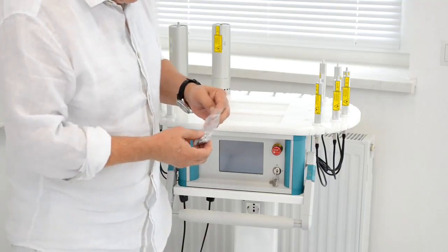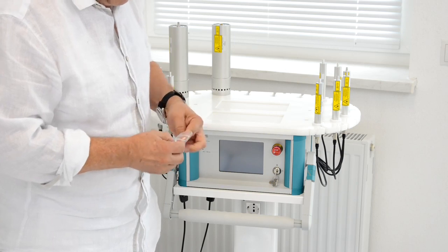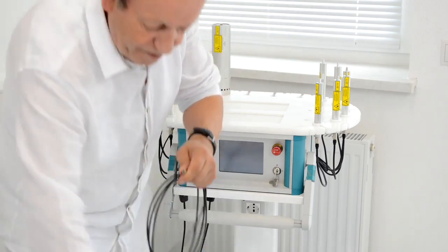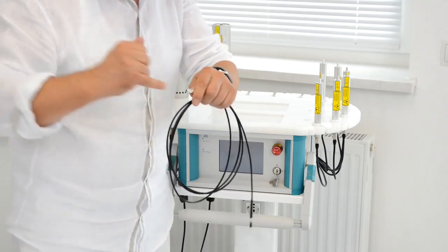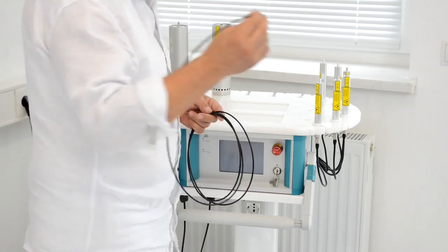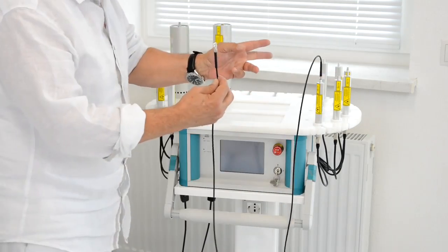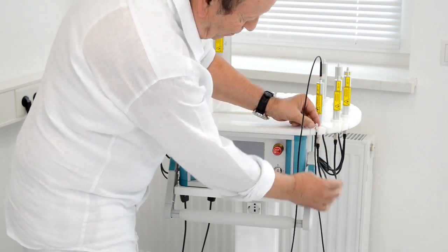So now I will show you how we connect the optical fiber to the different lasers. First of all, I take out this small connector, remove the black cap and fix it at the end of the cable, because this is the special adapter later for the laser catheters. The other end now will be screwed into the laser module. So the fiber is now connected, and I put it here in this hole of the holder plate.